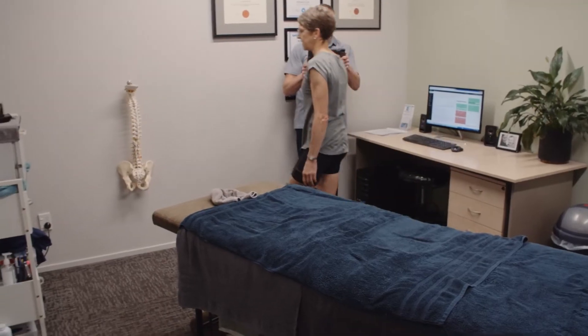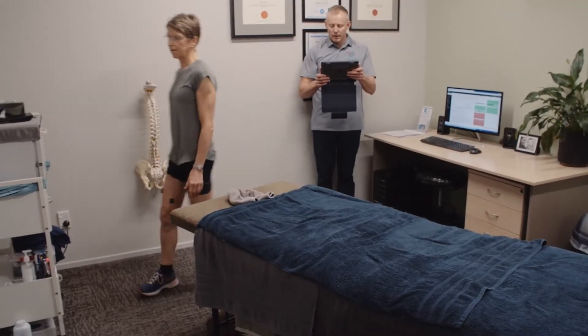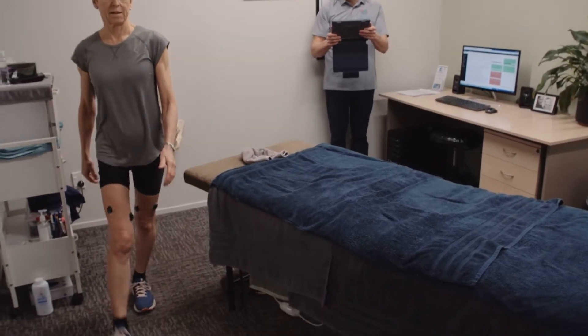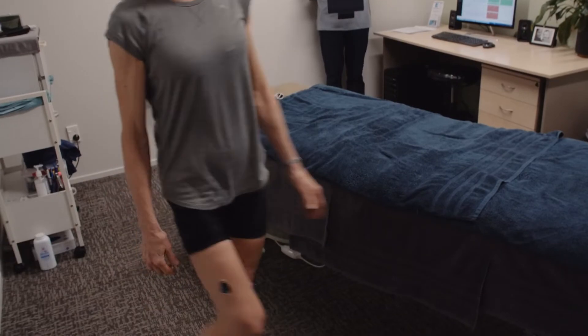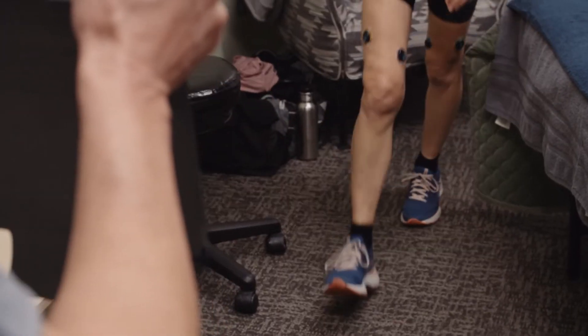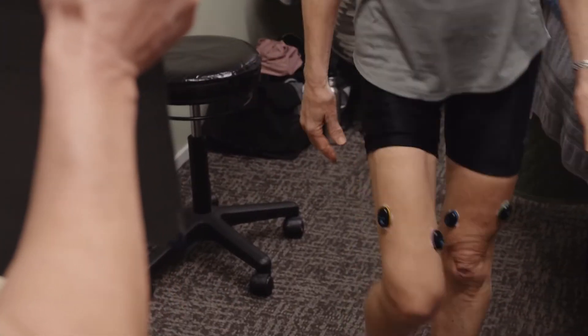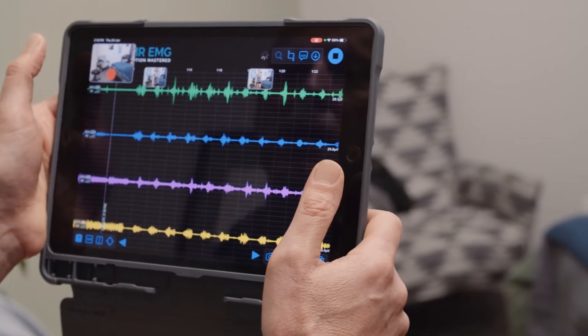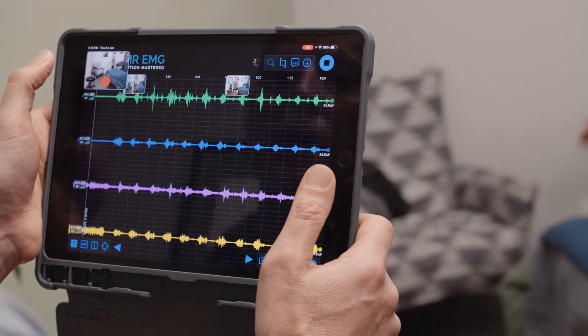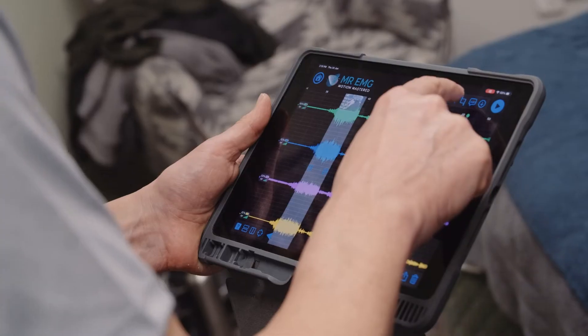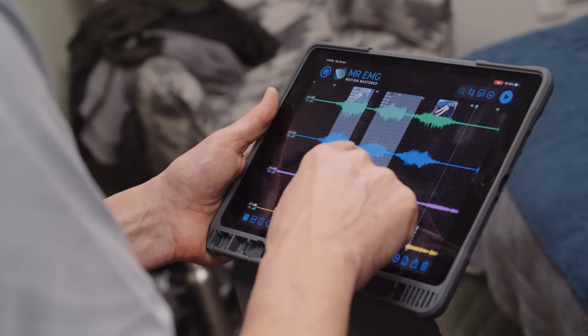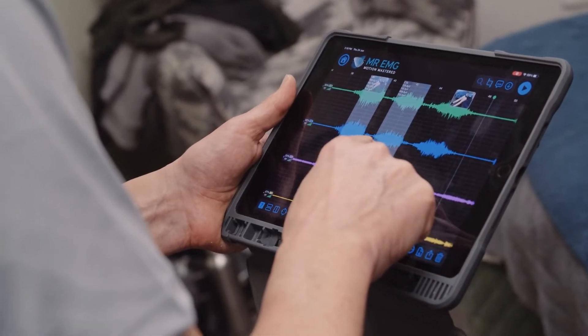Now record the quadriceps muscle activity of your subject's natural walking gait. Compare the muscle activity during walking gait to their maximal voluntary contractions, looking for any muscle activity abnormalities related to the complaint, such as a reduction of muscle function.